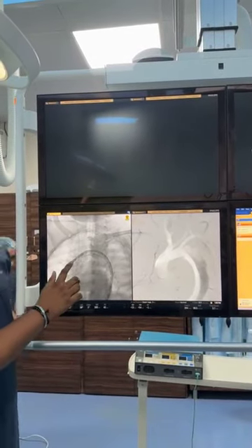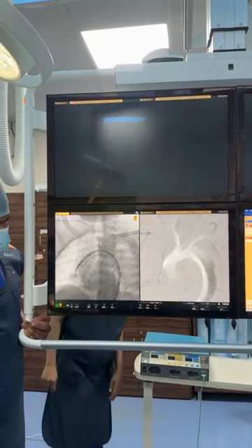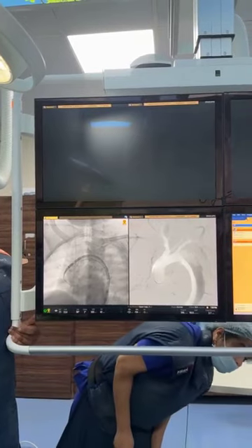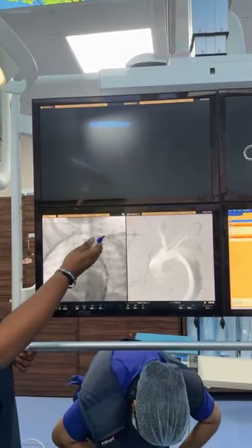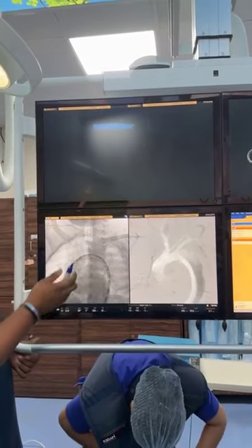Deep branching wire is a good landmark. Fix the device, sir. Yeah, fix the device. Okay. We'll take one more run, Prashant beta. So we'll not cover up too much higher. Take it to center, sir.